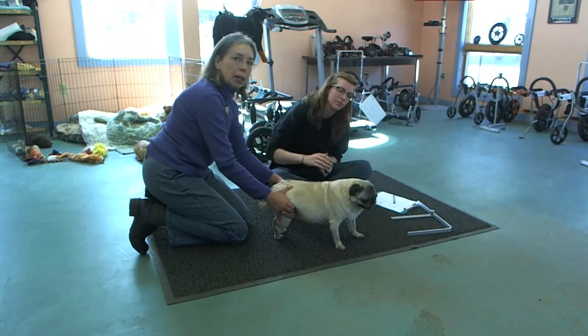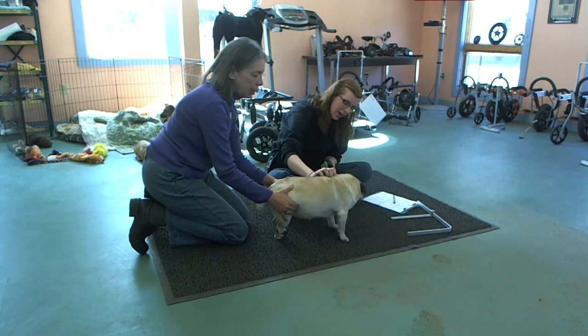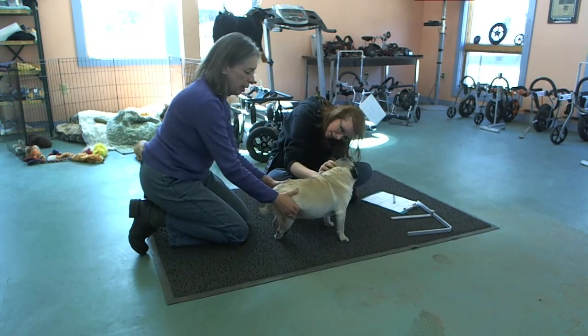We're doing a little demonstration about how to measure a dog here. We have Kayla — she's a little pug.